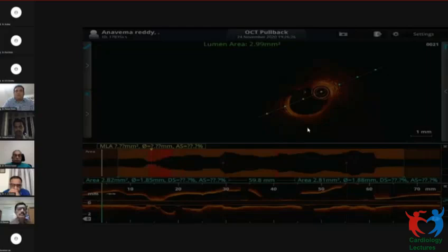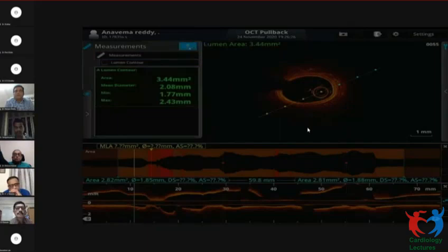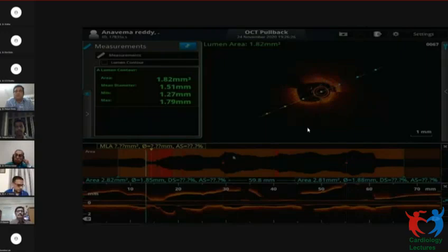And I will show now, you see distally, you can see here, this is a normal diameter. Trilaminar structure you are able to see. There is no plaque distally, but the plaque is here also, vessel is fine. Now if I take the diameter 2.1, but external elastic diameter is about 2.25, then I am coming proximally. You can see the plaque started. This is a fibrous plaque, and you can see a very, very critical lesion.